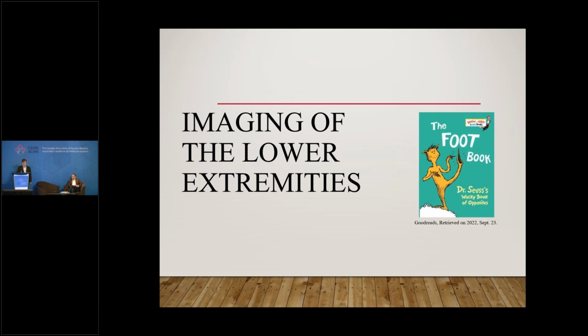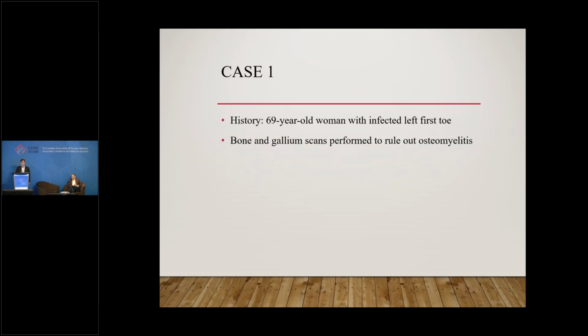So, we do lots of feet at the MUSC. So I'm going to show you a few cases of foot infection. So start with the first case. It's a 69-year-old woman with infected left first toe, and the question is whether the patient has osteomyelitis.